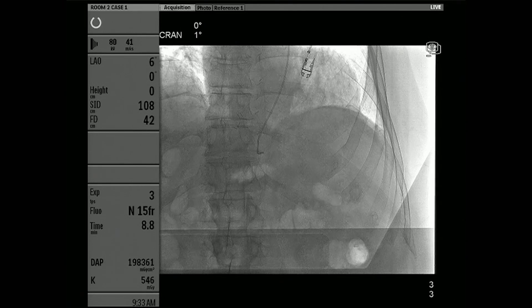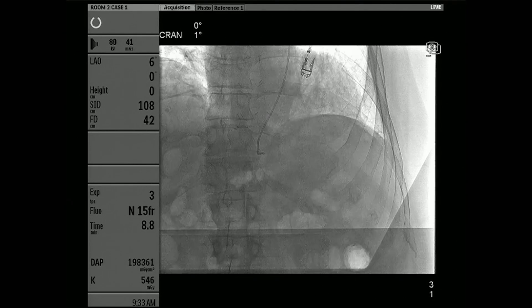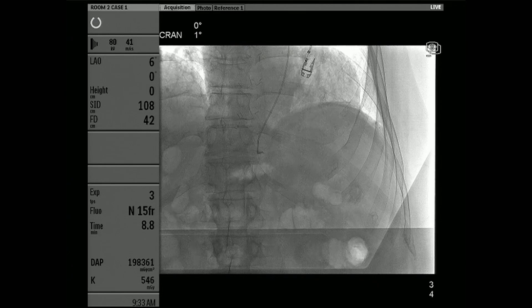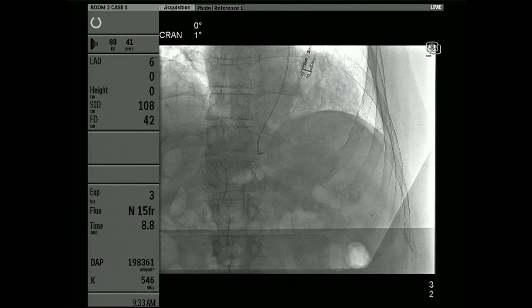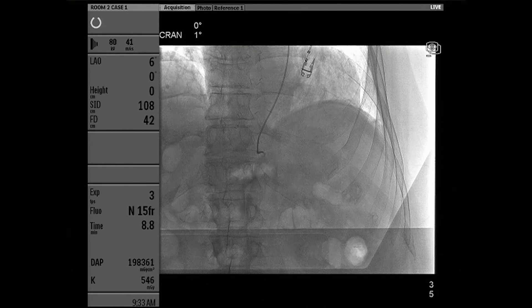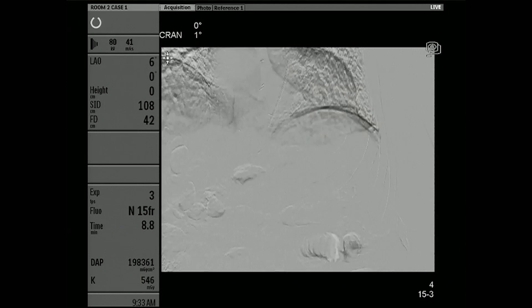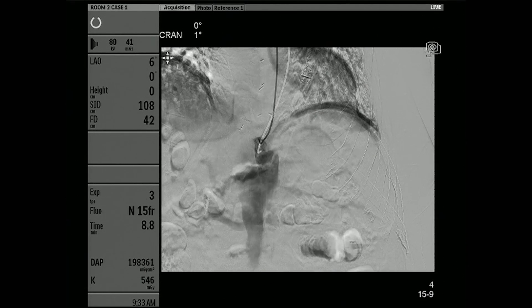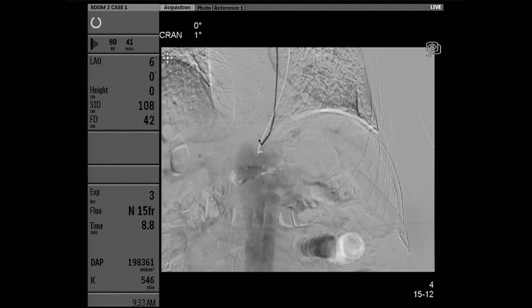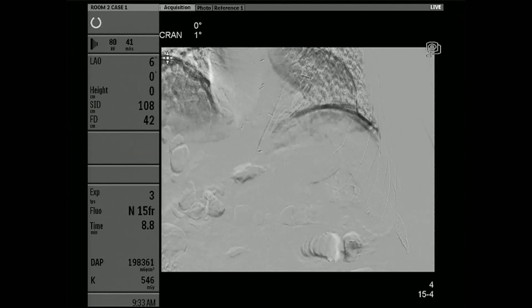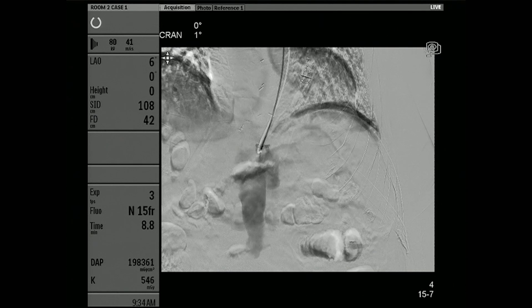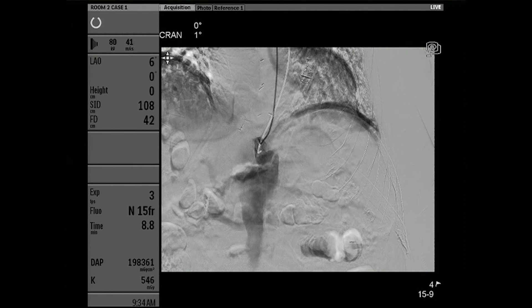The dissection actually creates very interesting anatomy here. We had to make sure we were in the true lumen and not the false lumen, and that the correct lumen was filling the celiac artery. You can see there's a persistent dissection with ectasia of the abdominal aorta — so not the easiest case.